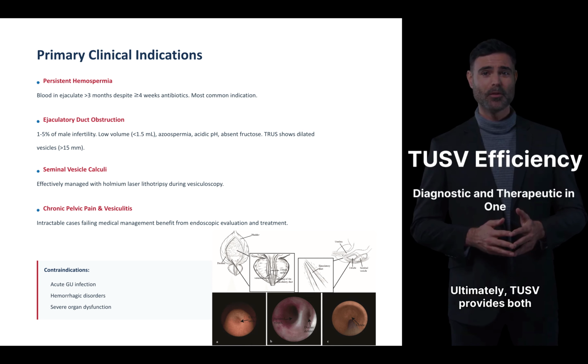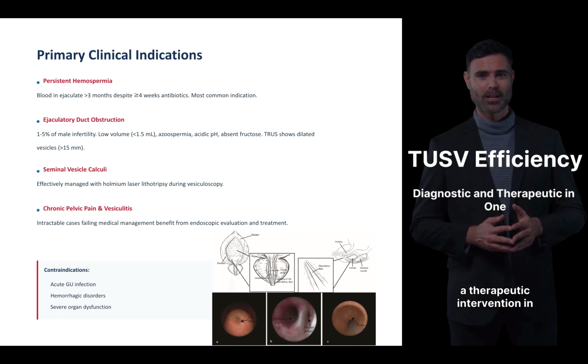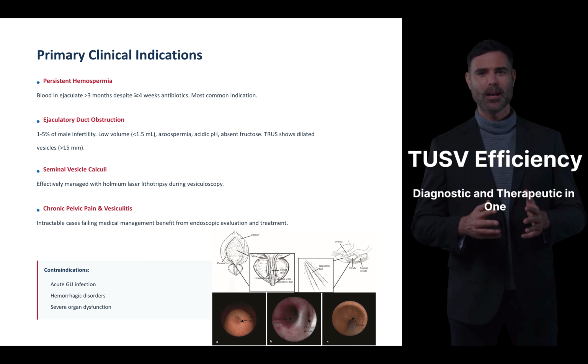Ultimately, TUSV provides both a diagnostic view and a therapeutic intervention in a single, efficient procedure, making it invaluable in urological care.